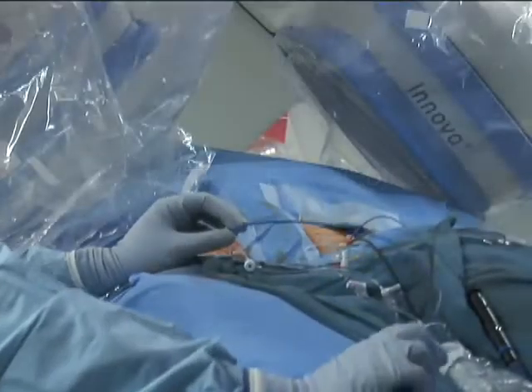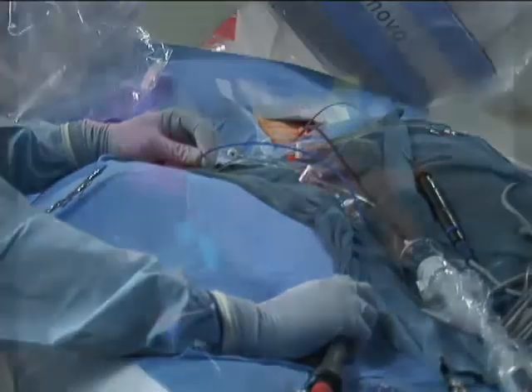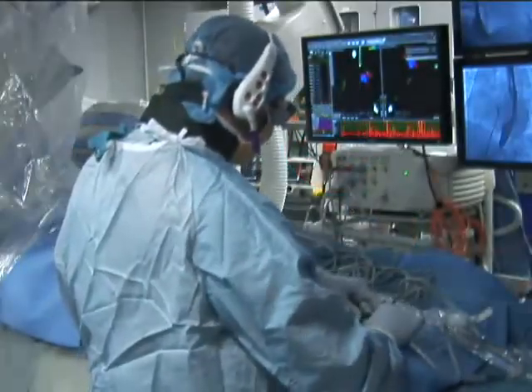The catheters are withdrawn into the right atrium and the heparin infusion is stopped. The ICE catheter is again used to scan for pericardial effusion. If there is a history of spontaneous or induced typical atrial flutter, a cavo-tricuspid isthmus ablation line should be completed. The catheters are removed from the body. The long sheaths are exchanged over a wire for short sheaths, which are left in place until the ACT decreases.